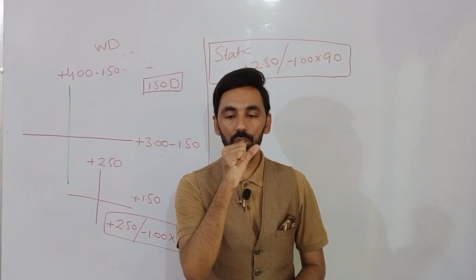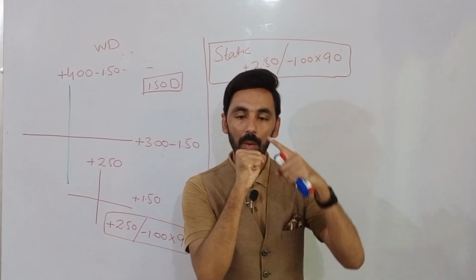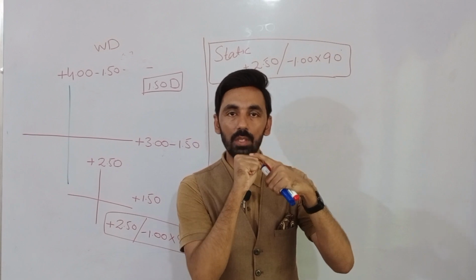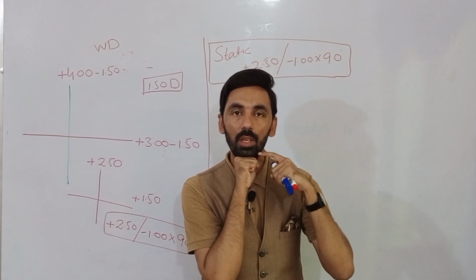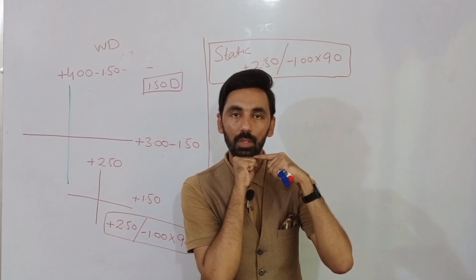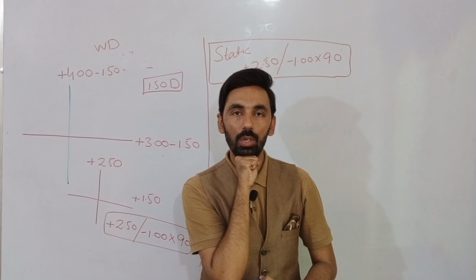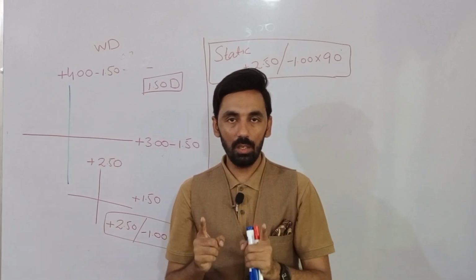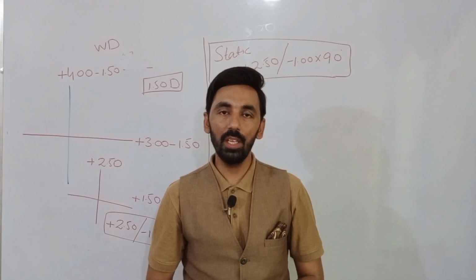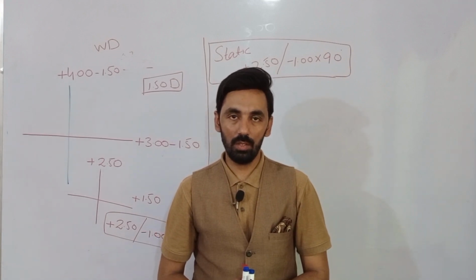You will ask the child to make a fist, and he is not going to punch you, but he will put his fist beneath his chin, and the distance between the upper side of the fist and the lower side of the elbow is called Harmon's distance. In adults, the distance should be 40 centimeter. In children, the distance should be Harmon's distance, right?